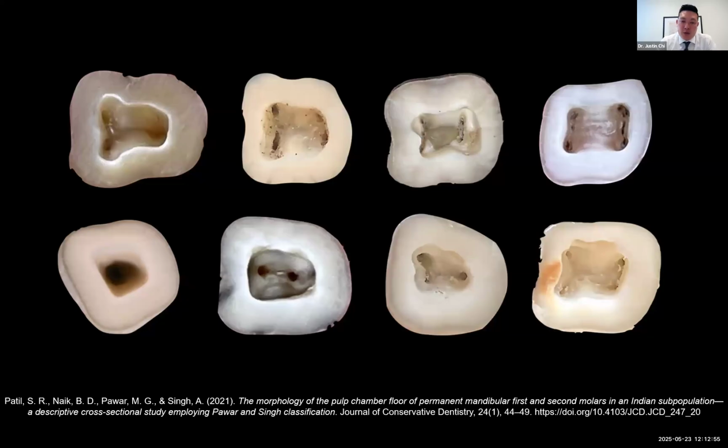And so what you really want to do, once the base has been established canal to canal, is have those transitions be nice and smooth and opened up. And from that base upwards, using a large tapered burr, diamond or carbide, it doesn't matter, the tapered nature of it, you just want to allow the walls from the base of the pulp floor to widen up smoothly. And then once you do reach the coronal portion, outside of that pulpal space, you want those transitions to be nice and smooth and flowing and rounded.